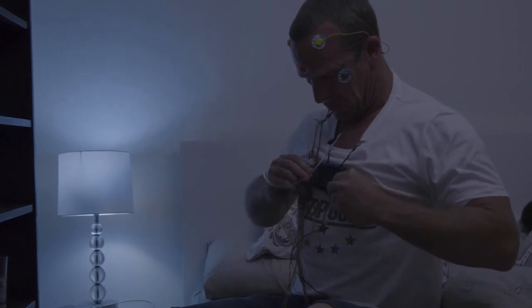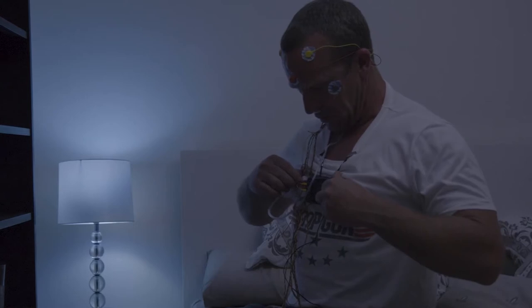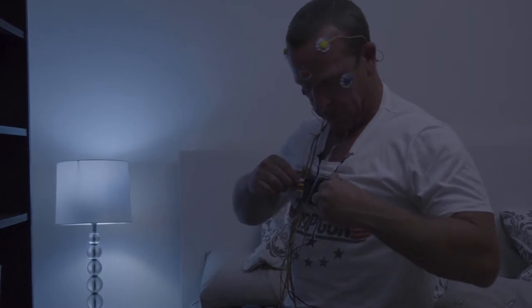Do not touch the buttons on the machine. Your sleep tech will have set the device to automatically start and touching these buttons may result in a failed study and further fees.